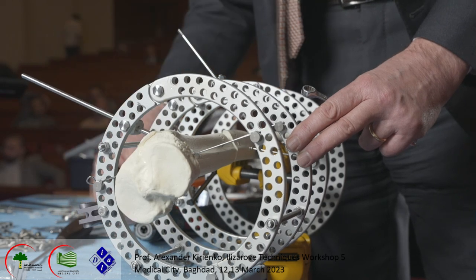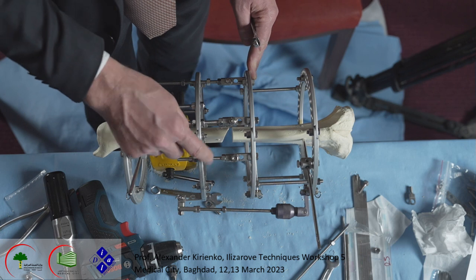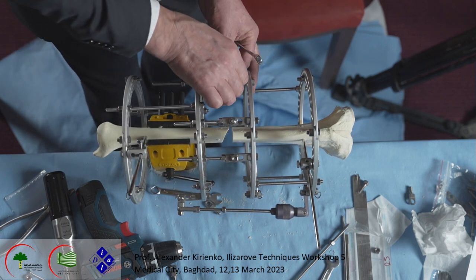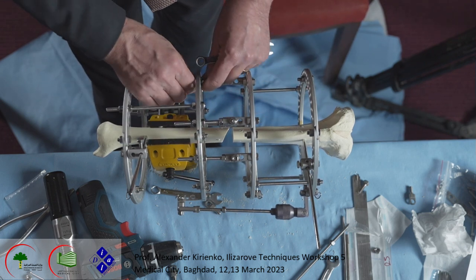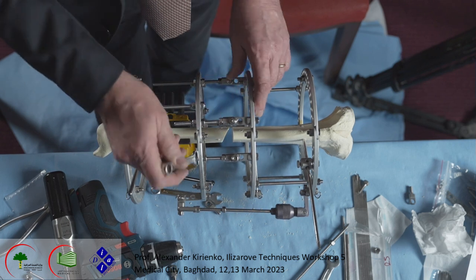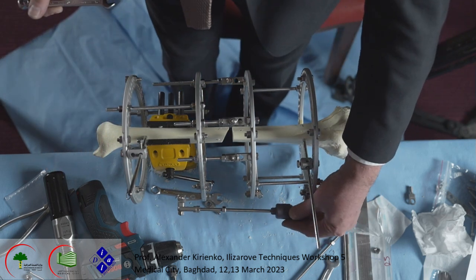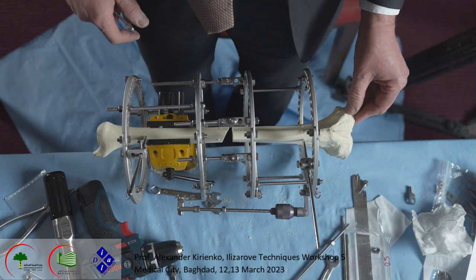This rod is quite finished. Okay, like you see now, this motor functioned, it became parallel because the rings are parallel, they are a symmetrical system, symmetrical rod here and here and here. And practically we are finished. And this motor was really helpful because it is more powerful and situated medially.